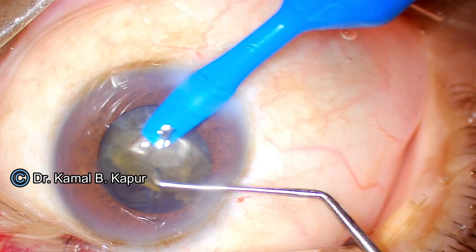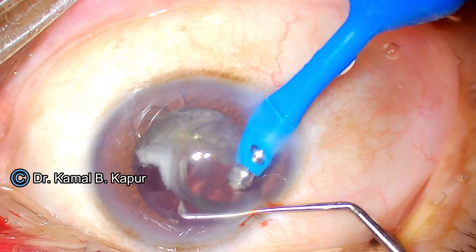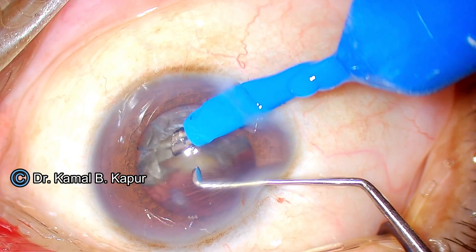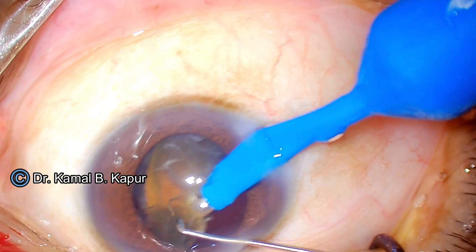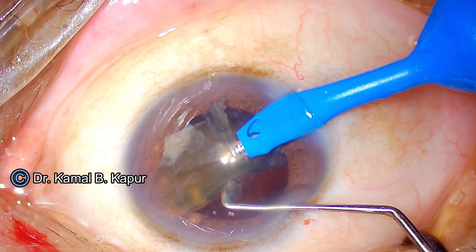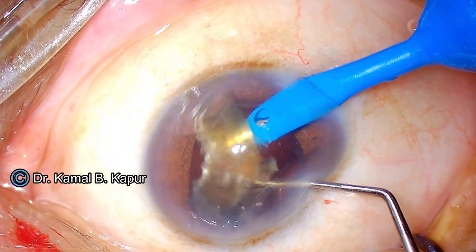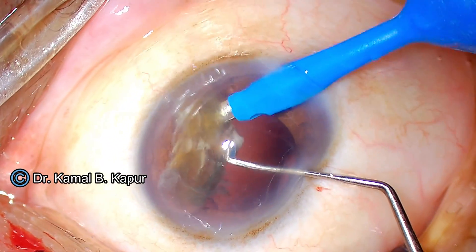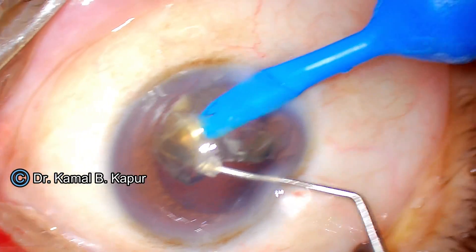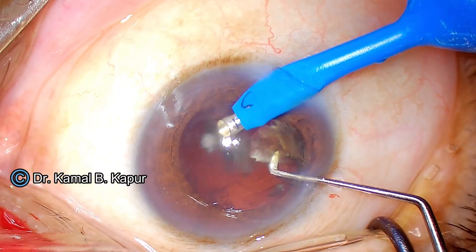Without any chamber fluctuations, we perform phaco-emulsification at the pupillary plane, making sure we are not letting go of any loose piece. After the plate is removed, we can see the PC is open — note the fluctuation and the capsular flap sign, though there are no fluctuations in the anterior chamber. We tilt the phaco tip to the opposite side. The D segment was actually wanting to subluxate into the vitreous, but controlled vacuum and phaco power ensured no piece of the cataract went through the posterior capsular opening. The procedure is now being done in the anterior chamber — not the pupillary plane — to avoid losing the cataract piece. My left chopper is supporting the loose cataract piece near the wound, holding it so it does not sink.